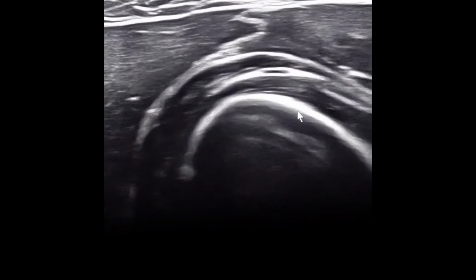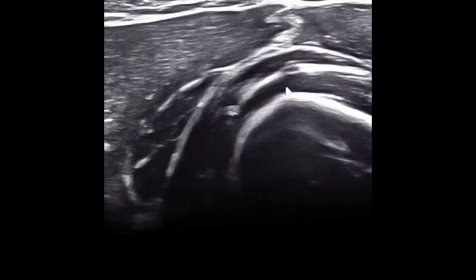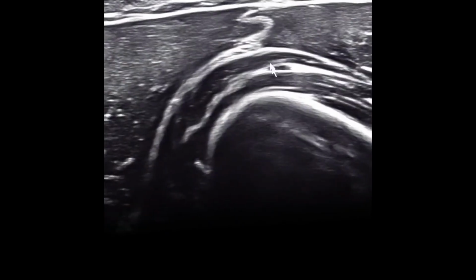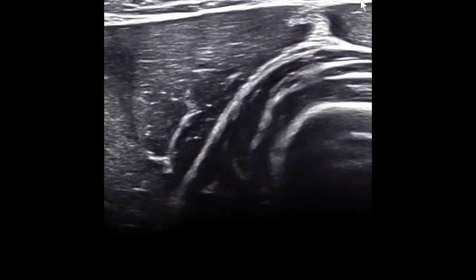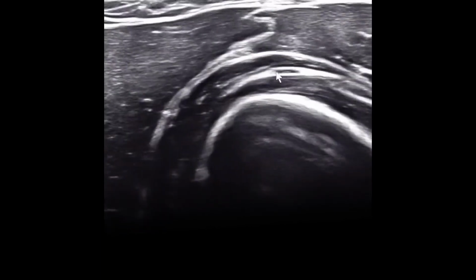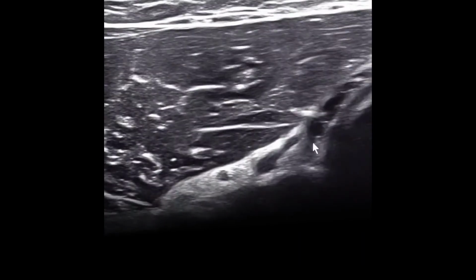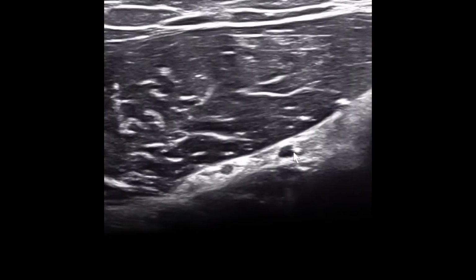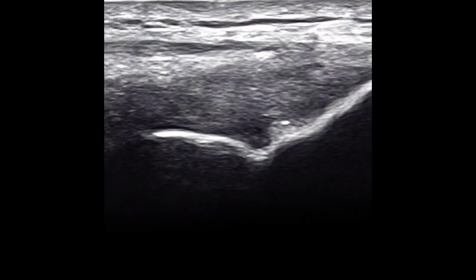So this is the image, a cine clip of a patient with pathology, and this is inside, this is the nerve, inside the radial tunnel, two heads of the supinator muscle, superficial head, deep head, and the nerve has passed from above to below, crossed this arcade of Frosch, and we see the size of this nerve, and you see how small the nerve is here. However, if I go to this image here, this is the nerve, and you will see, this was the artery. So these are the images of the patient.